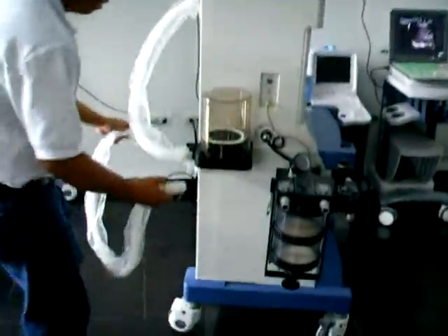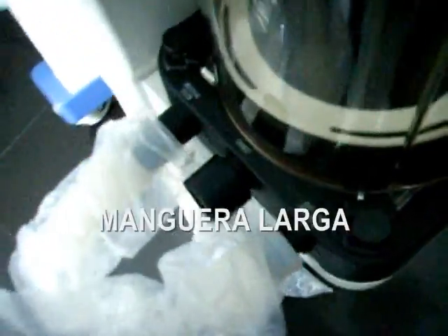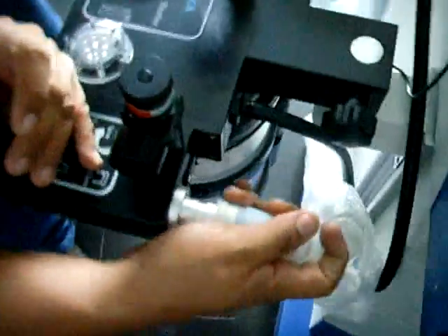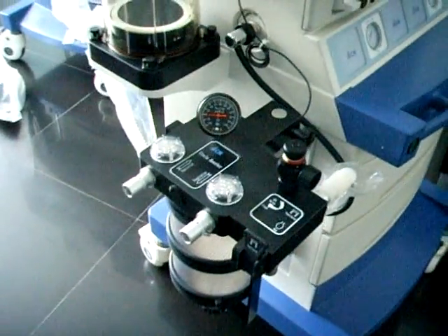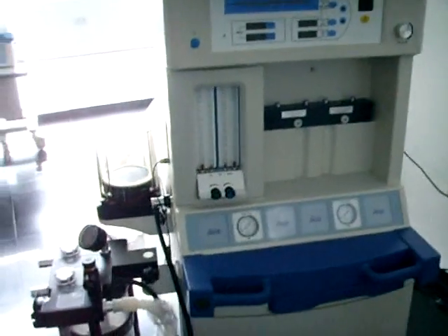Ahora tomamos una segunda manguera, una de las mangueras largas, y la conectamos al otro extremo del fuelle. Esta será la conexión entre el fuelle y el otro terminal, conectándose al canister. Esta es la forma como nosotros conectamos las mangueras corta y larga de la máquina de anestesia.